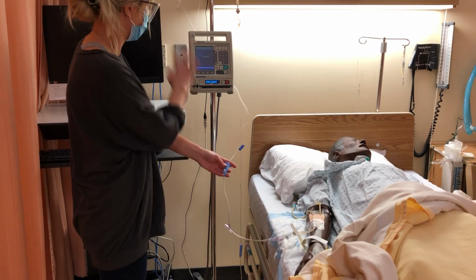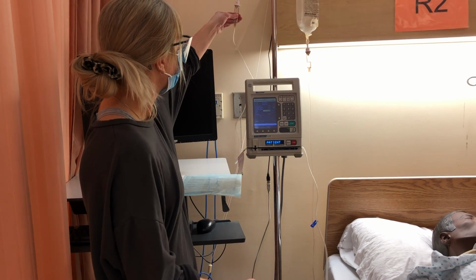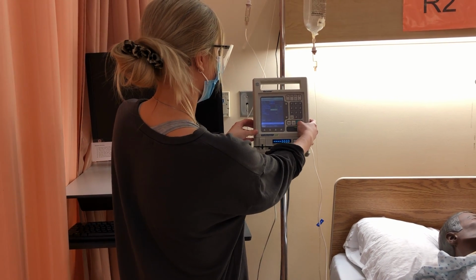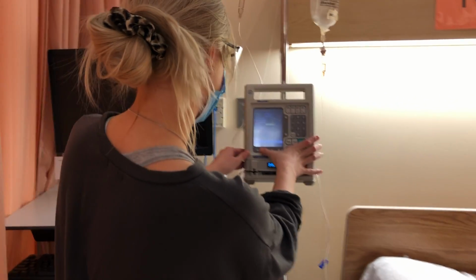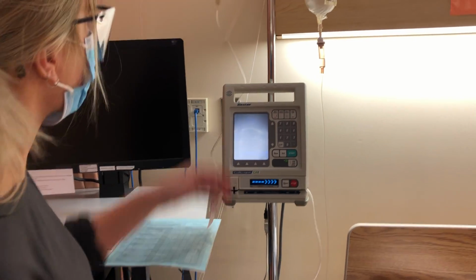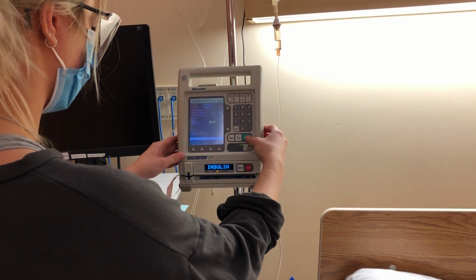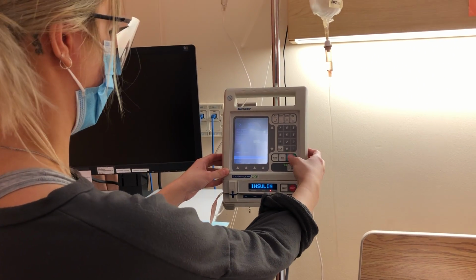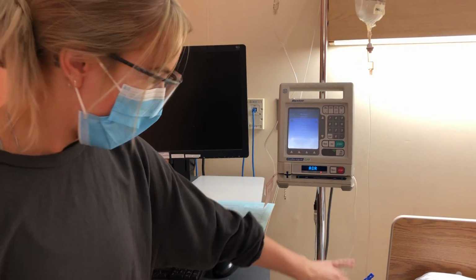Okay, so now that it is all connected well, I can unclamp. So I can unclamp and then I can press start. Make sure we're on clear. Now that it matches, you can go ahead and move to medication. So start. Okay. Remove it. Now I can clamp.